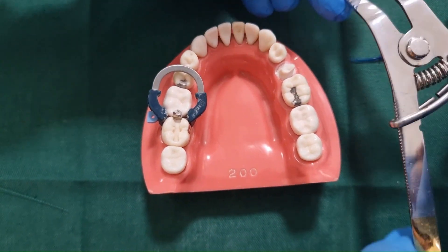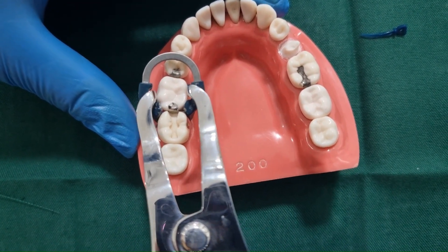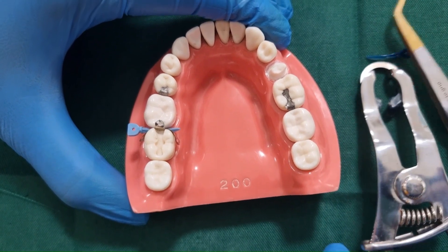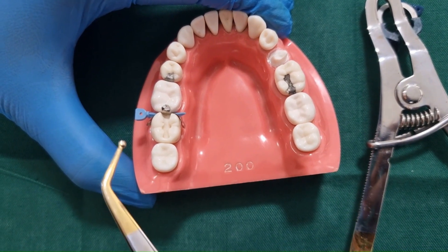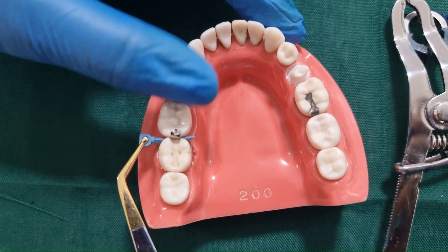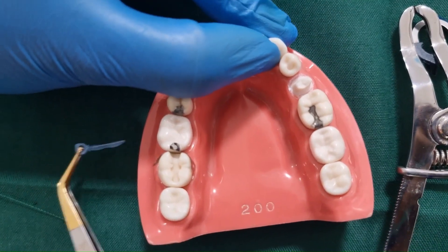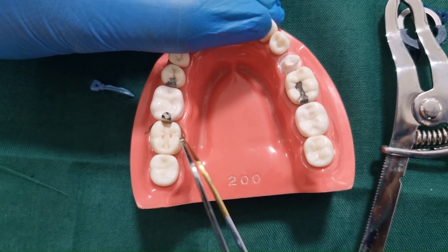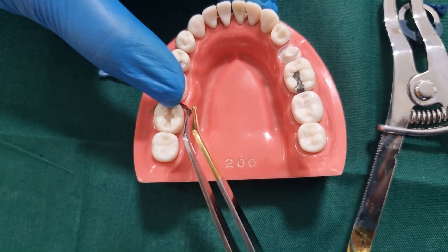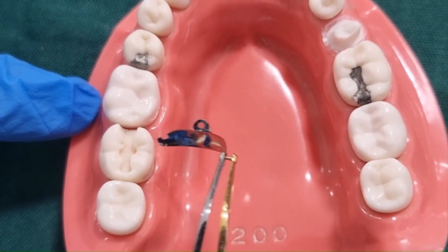Once the restoration is completed, first remove the V3 ring gently. Then using the pin tweezers, tease the wedge gently and remove it, followed by removal of the matrix band. You can grip the hole in the matrix band using the pin tweezer and remove it in the buccolingual direction. It is normally removed from the buccal aspect.